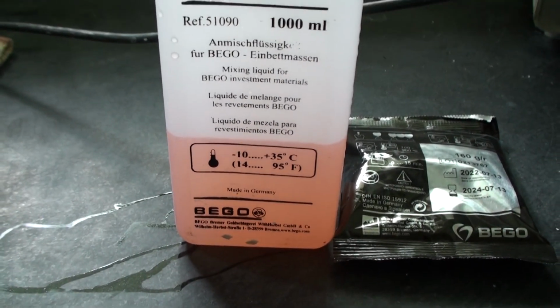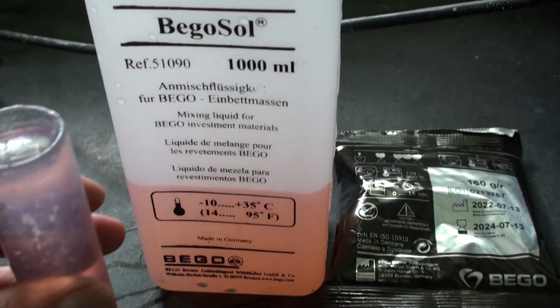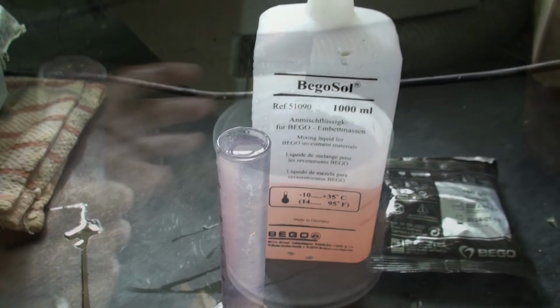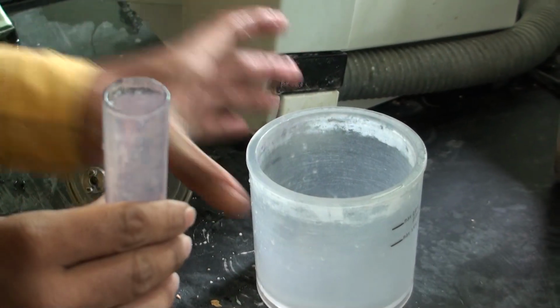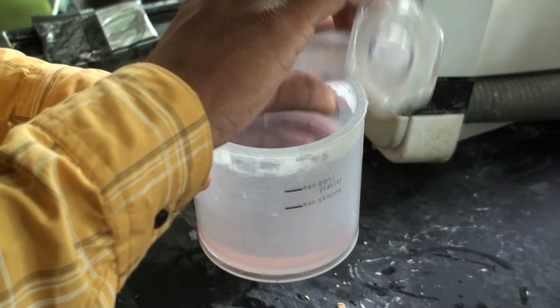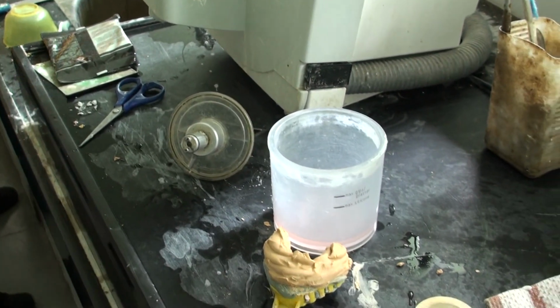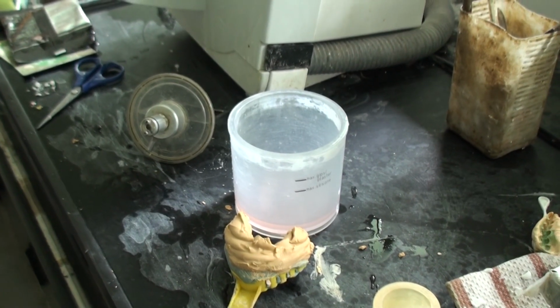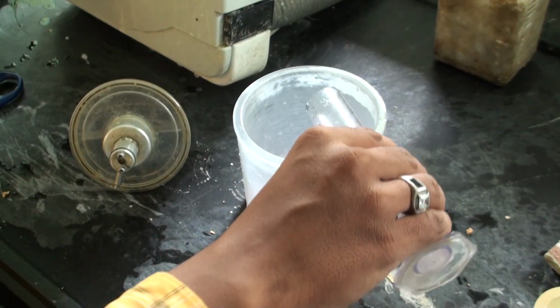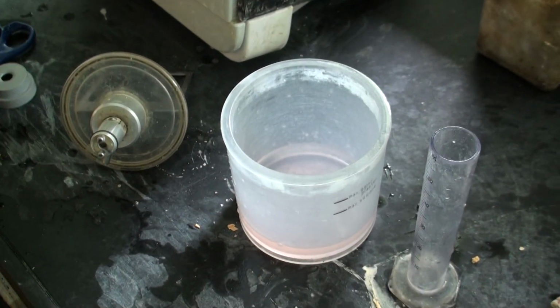It again comes in the form of a powder and a liquid, and as you can see, it needs to have a precise water powder ratio and gets put into the mixing pot, the right amount of liquid, and we put the powder into it.